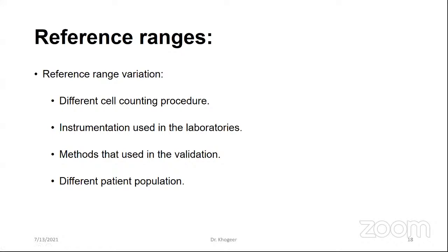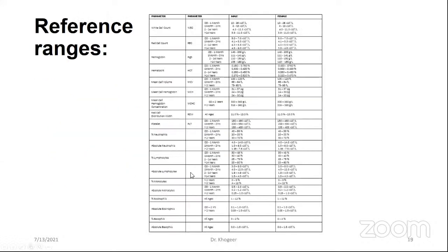Also, different reference values may be given to different patient populations. So this is the reference value that we follow in the King Faisal Specialist Hospital.